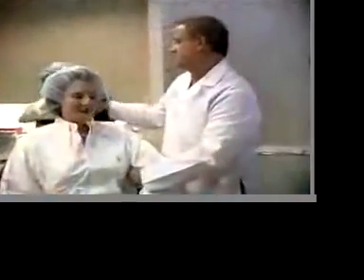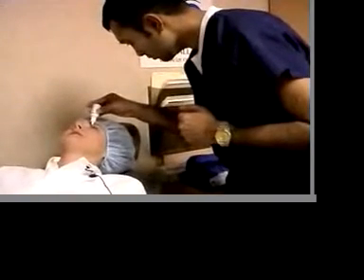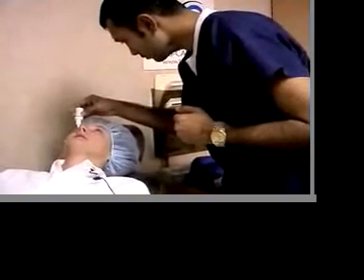And then after that whole procedure with the laser, we take you out of the room, we walk you back into this little post-op room, and then we lie you back in a chair at about a 10-degree angle looking up at the ceiling, because we found that gravity working this way on your eyes and blinking helps make that flap even better within a few minutes. You're there for 15 minutes while we put drops in, and then we put these little bitty clear plastic shields over your eyes, and you go home.